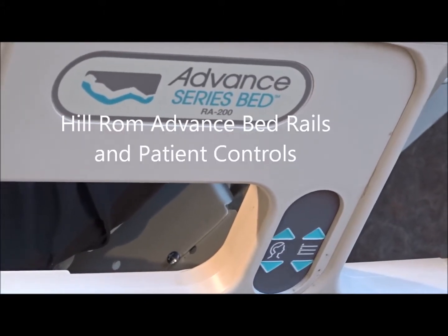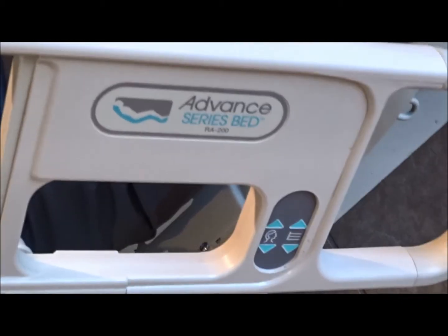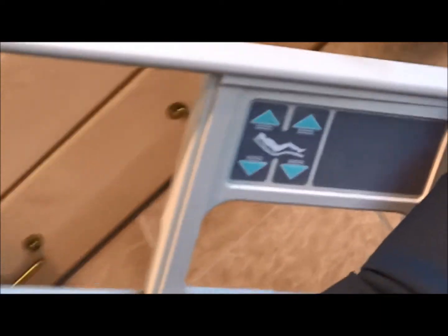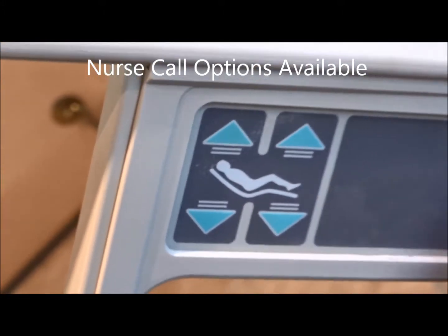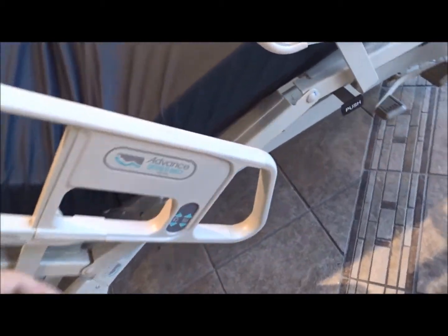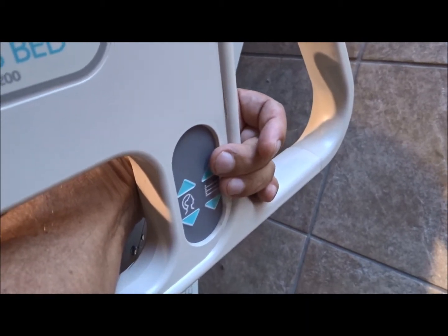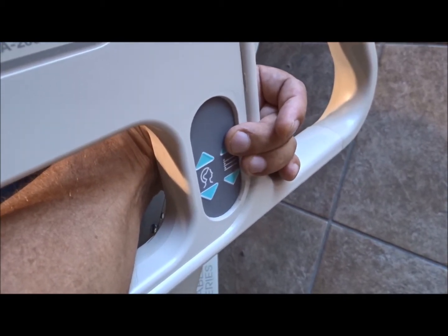The Hillrom Advanced Series Bed has controls on the outside rail for the caregiver. The patient can also reach in there to raise the bed up and down, and on the inside of each patient rail you have the controls for the patient. The patient can control head up and down and foot up and down from inside each rail. On the outside of each rail you've got caregiver controls, and it's very easy to raise the bed to assist yourself up and get to your feet if you need that assistance.